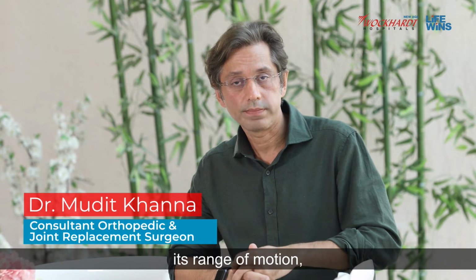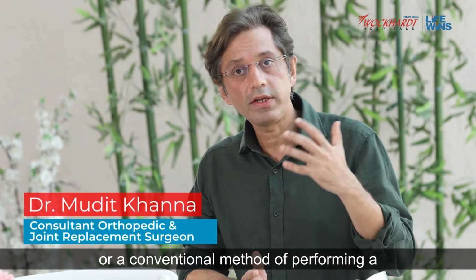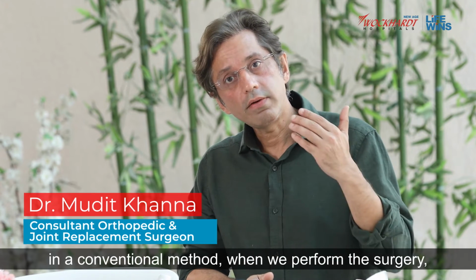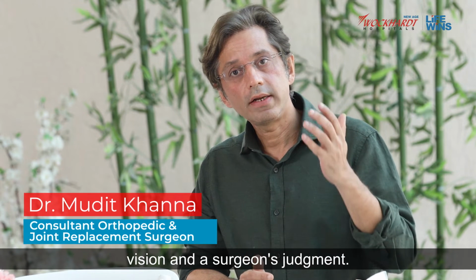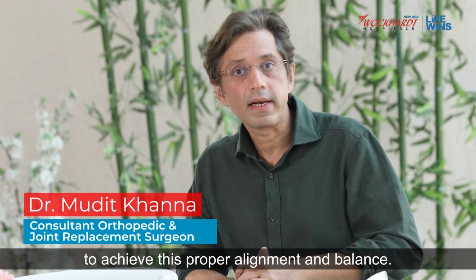Coming back to the traditional or conventional method of performing a knee replacement surgery, we primarily rely on the surgeon's vision and judgment to achieve this proper alignment and balance.